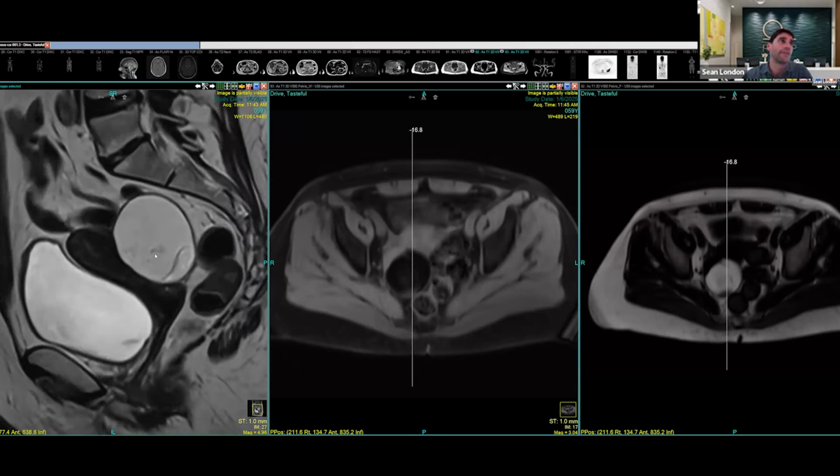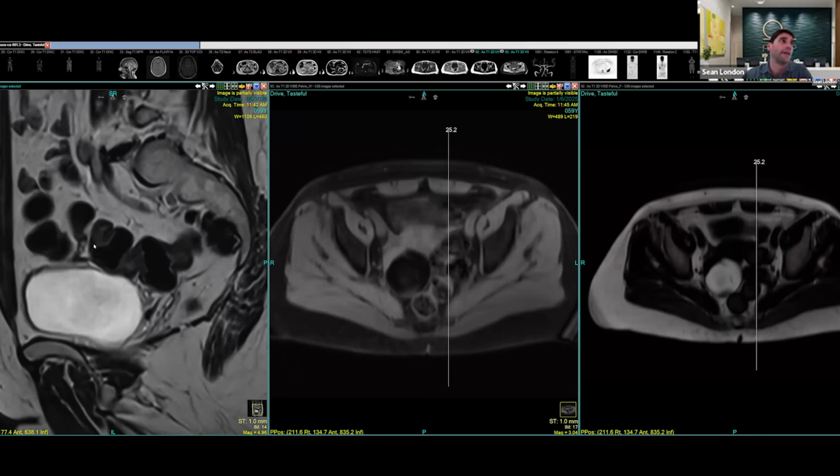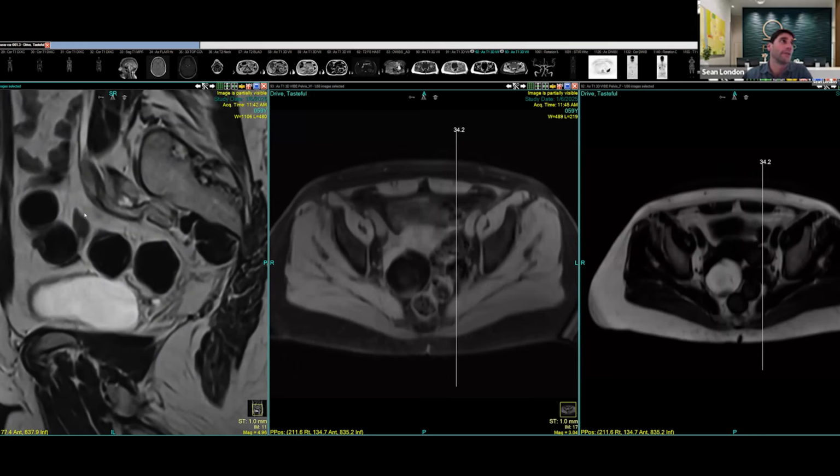And then just in comparison, this is what the other contralateral left ovary looks like. This is what the right ovary should look like. It's nice and small, and they tend to shrink down in size in postmenopause, even to the size of a raisin. This one is small, but I don't see anything concerning going on in the left ovary. I cannot see the fallopian tubes unless they're pathologic, unless they're abnormally dilated or there's a cancer coming from them. So the fallopian tubes are generally not visible to us on imaging.